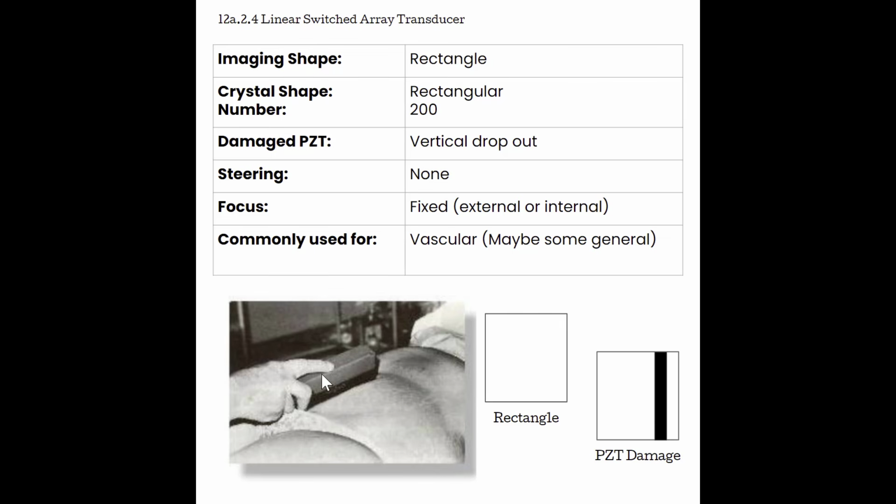That is why it needed to be so big, so we could get more of a view of the abdomen or more view of the vasculature. Something like this would not work for rib spaces. We would have tons of rib shadowing, really obscuring a lot of the information that we would be looking for if we were trying to look at the heart.